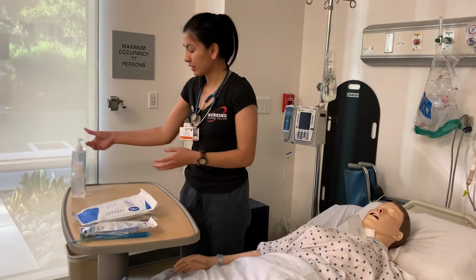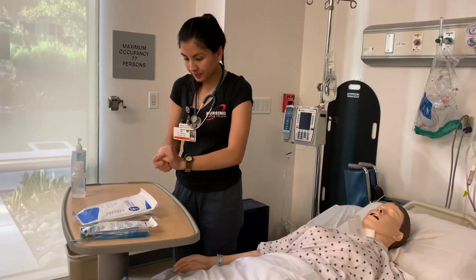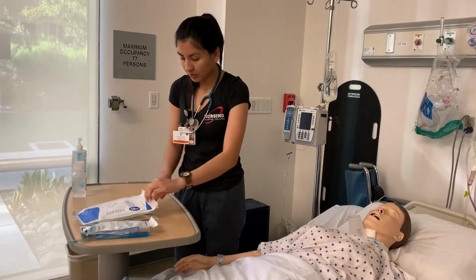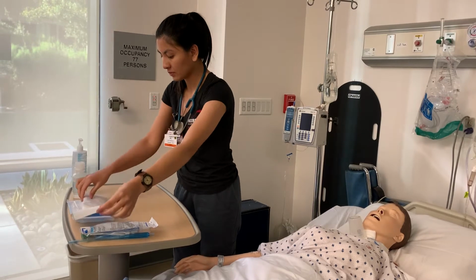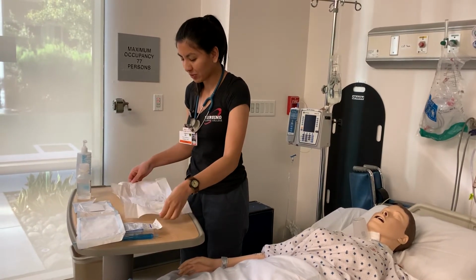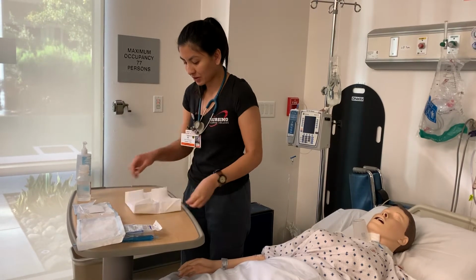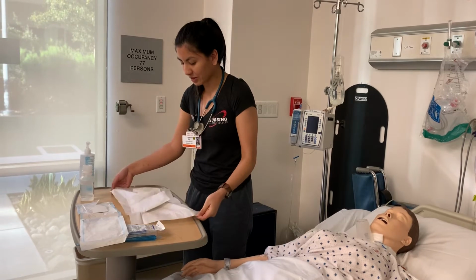I'm going to perform hand hygiene. That's loosened. And open this. I would also have brought an extra pair of sterile gloves in case I messed up, or I could always hit the call light if I did.